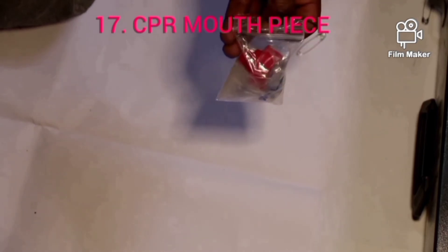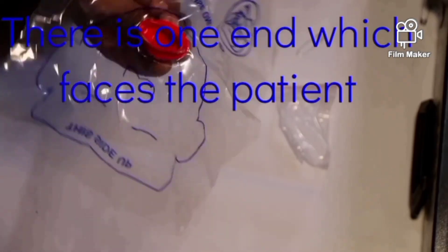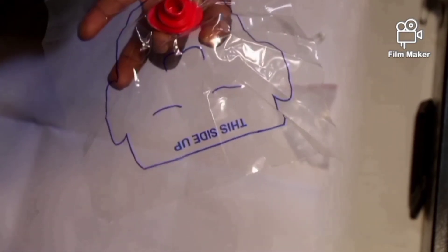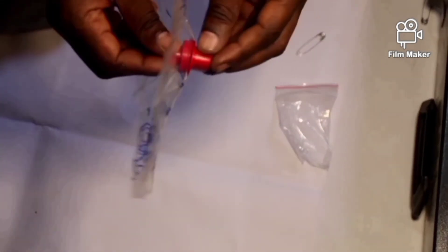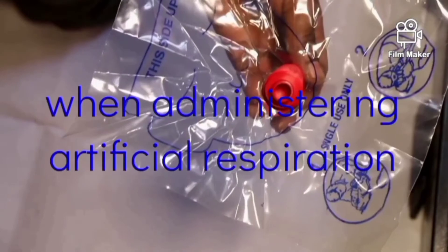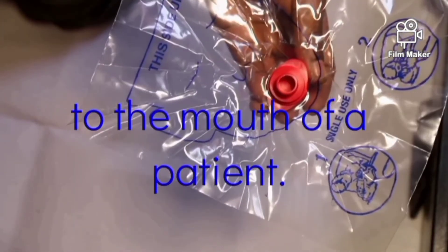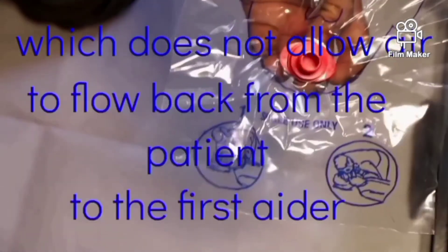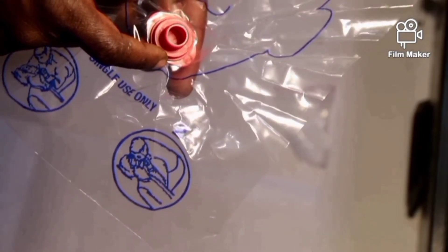The CPR mouthpiece comes in a quantity of two. There is one end which faces the patient and the other end which the first aider uses. It is for single use only — this side must face up for the first aider to blow air, and this side must face the patient. The CPR mouthpiece is used when administering artificial respiration from the mouth of the first aider to the mouth of the patient. It avoids mouth-to-mouth contact and has a one-way valve which does not allow air to flow back from the patient to the first aider.